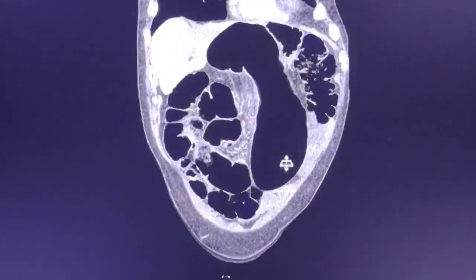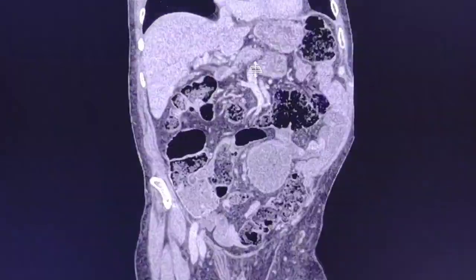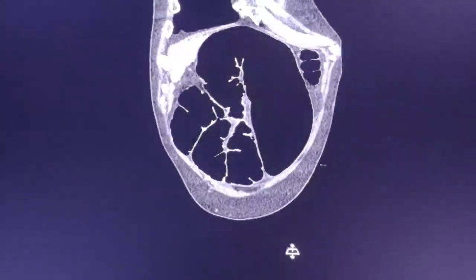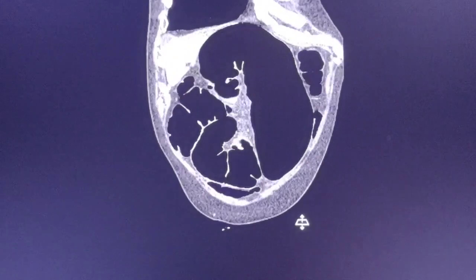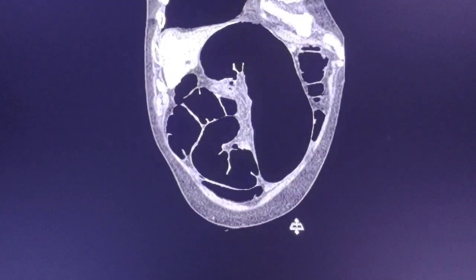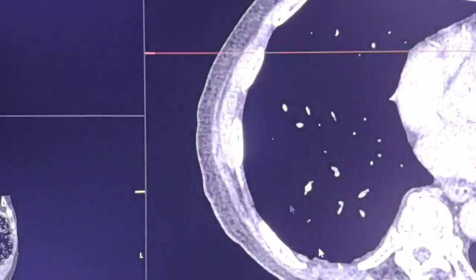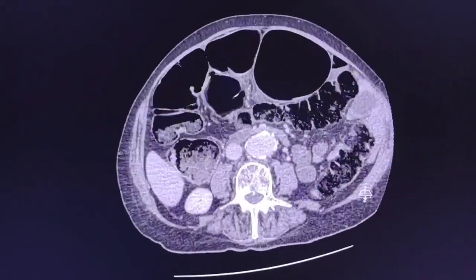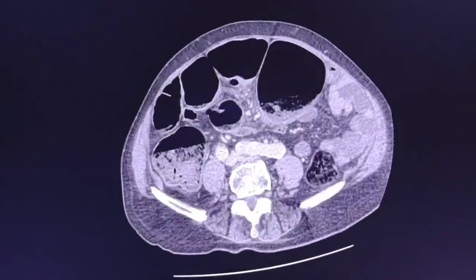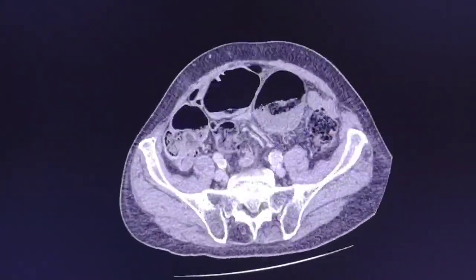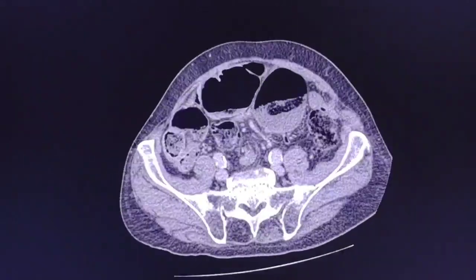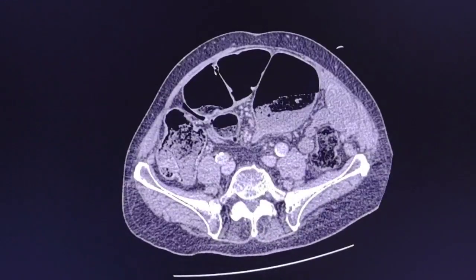As we can see, there is significant dilatation of the bowels. Next is to find the obstruction — the level of the obstruction.